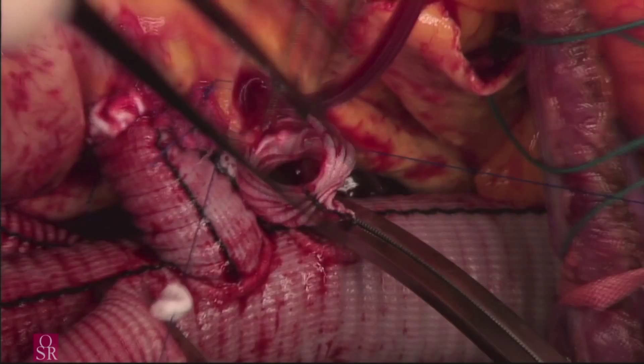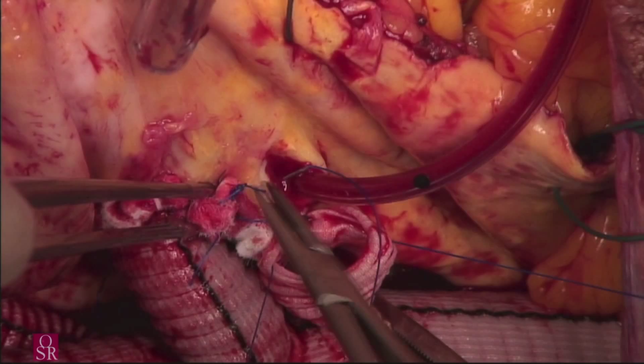These individual anastomoses can be safely and quickly accomplished when the visceral vessels are far away from each other, but can be technically difficult if the vessels originate close together.